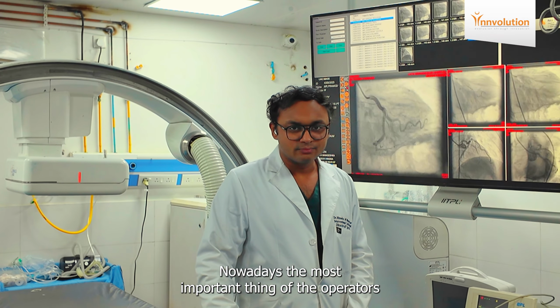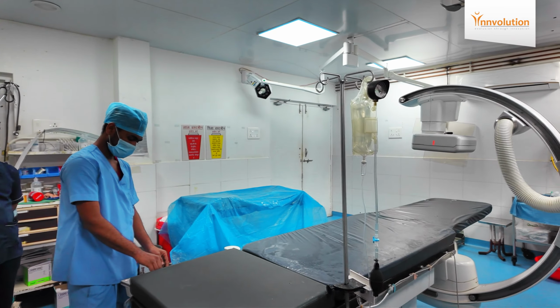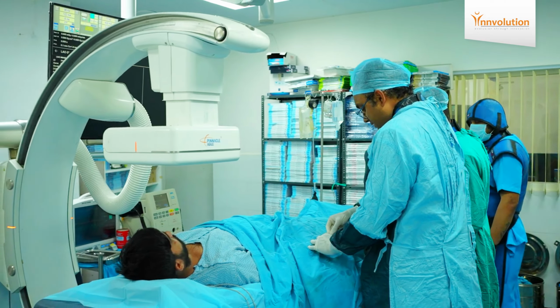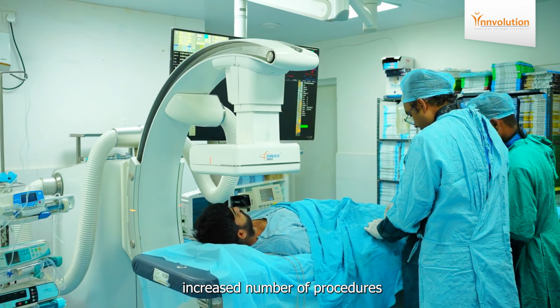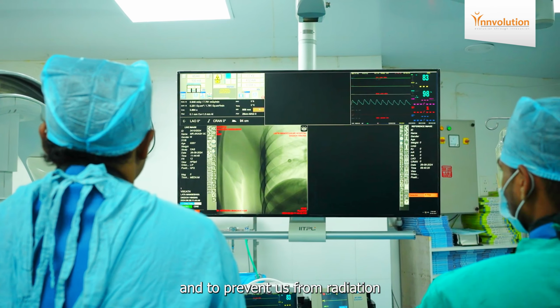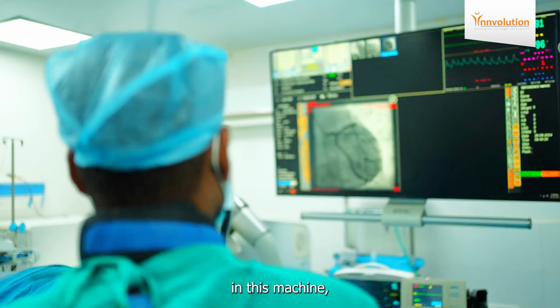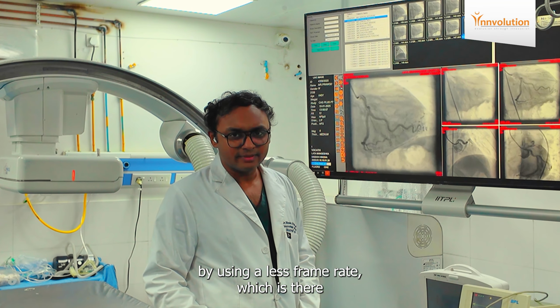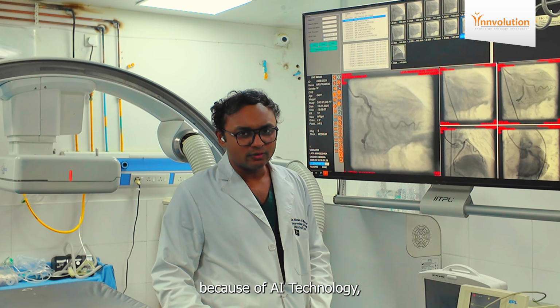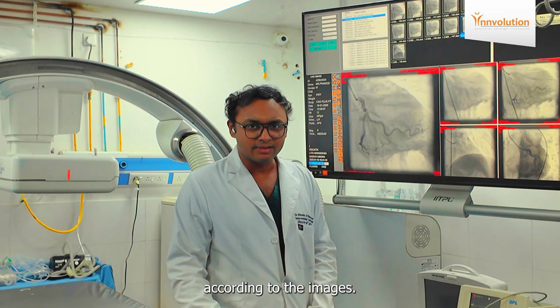Radiation safety nowadays is the most important thing for the operators who are working inside the cath lab, because with the increased number of procedures, the most important thing is to have less radiation and to prevent radiation injury. We can take a lot of precautions in this machine by using a lower frame rate. Because of AI technology, we get a lower frame rate, and it adjusts itself according to the images.